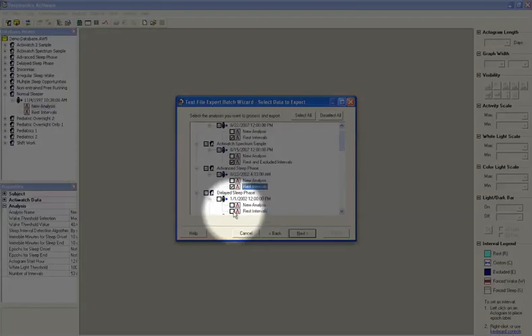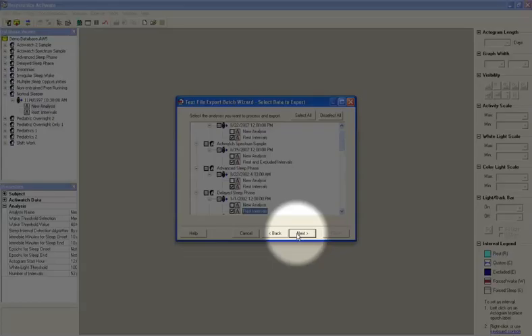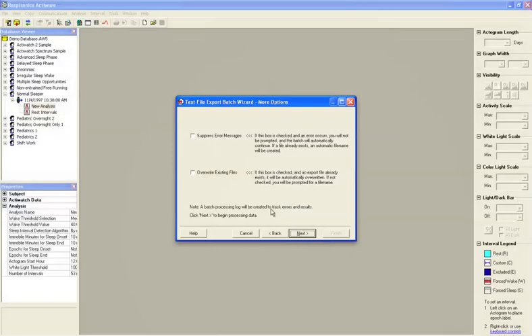In the case of individual export files, a single CSV or comma-separated file will be generated for each of the analyses that you select. Once you've picked all the analyses you wish to include, click the Next button.